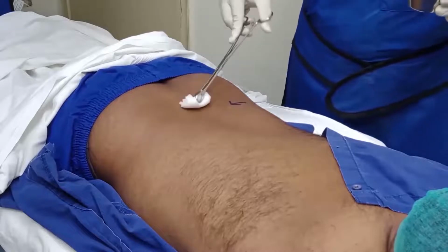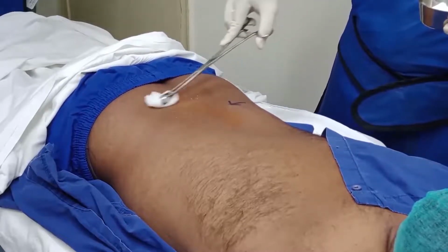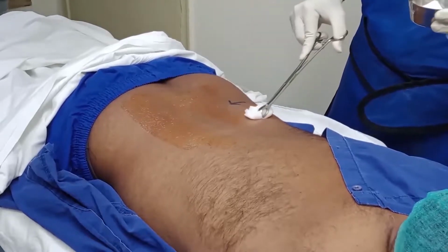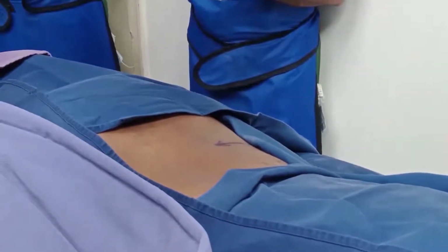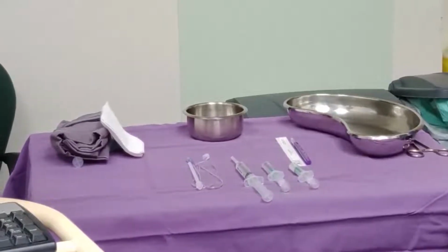The patient's skin is prepared with a 2% chlorhexidine solution, ensuring that the entire area is prepped properly twice. The entire prepped area is draped with sterile sheets. The sterile procedure trolley is prepared.